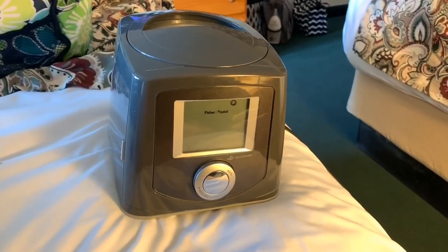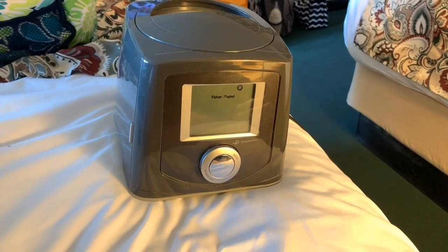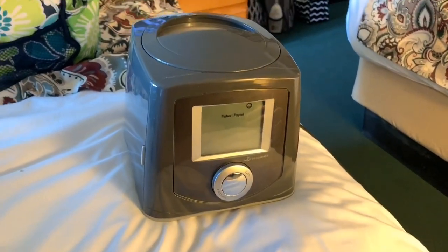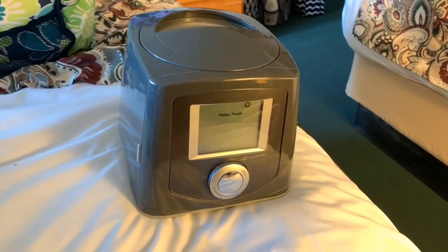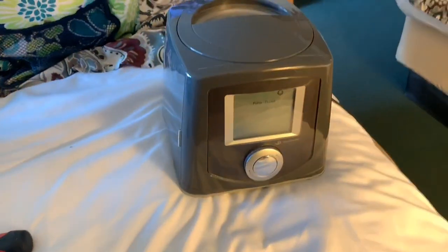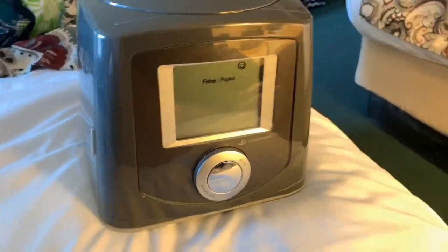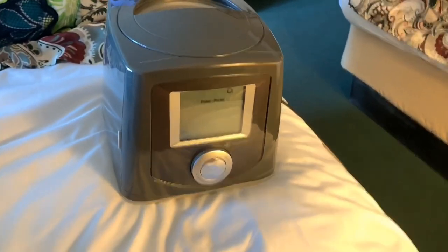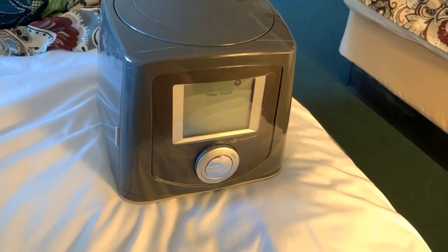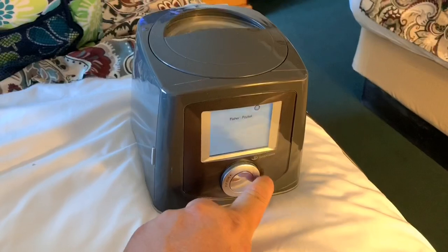This is a little help video. If you have a Fisher & Paykel Auto Icon CPAP machine and you unplug it to travel, put it in a carrying bag like you always do, and you get to your destination, you plug it in and it's completely dead. Just a few minutes ago I got to my hotel and the thing is completely dead — it will not power up, nothing will happen.